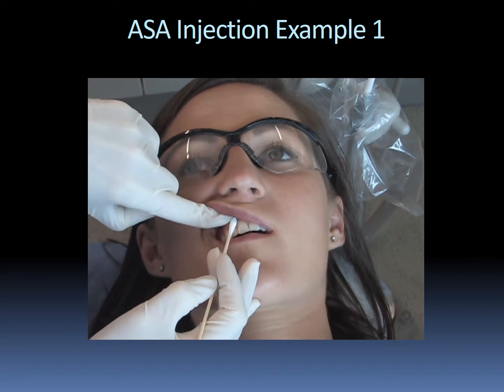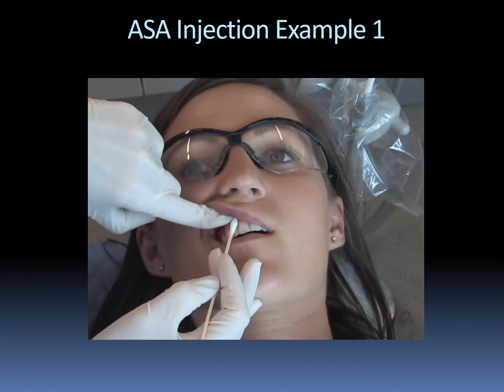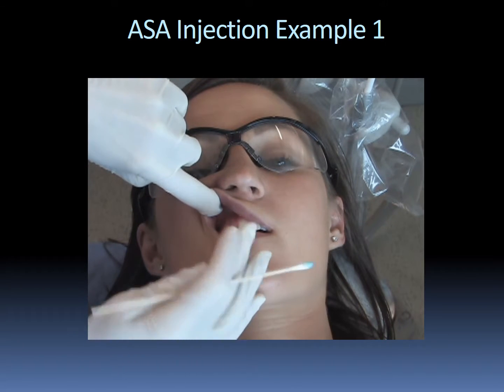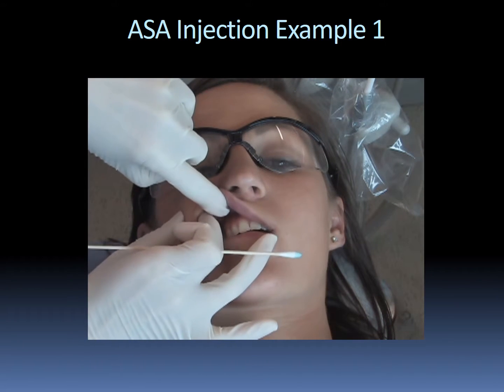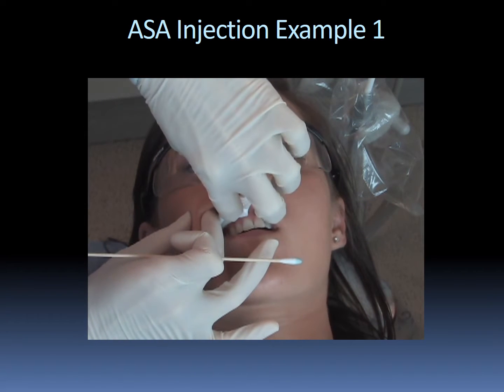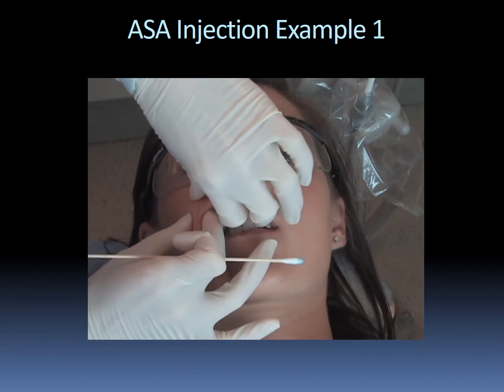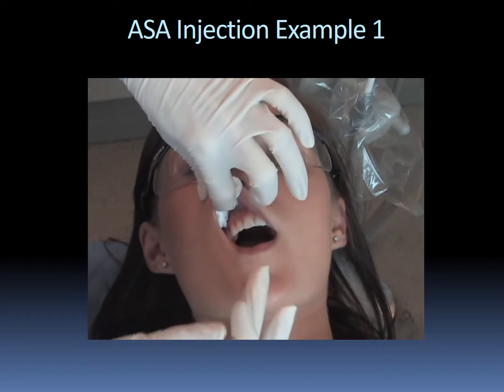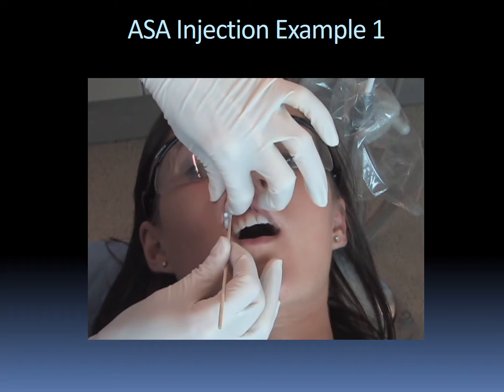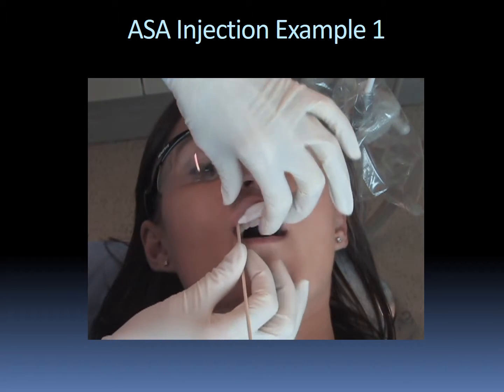Palpate the canine eminence and canine fossa, which is the slight depression located just anterior or medial to the eminence. Place topical at the mucobuccal fold of that area for at least 1 minute.